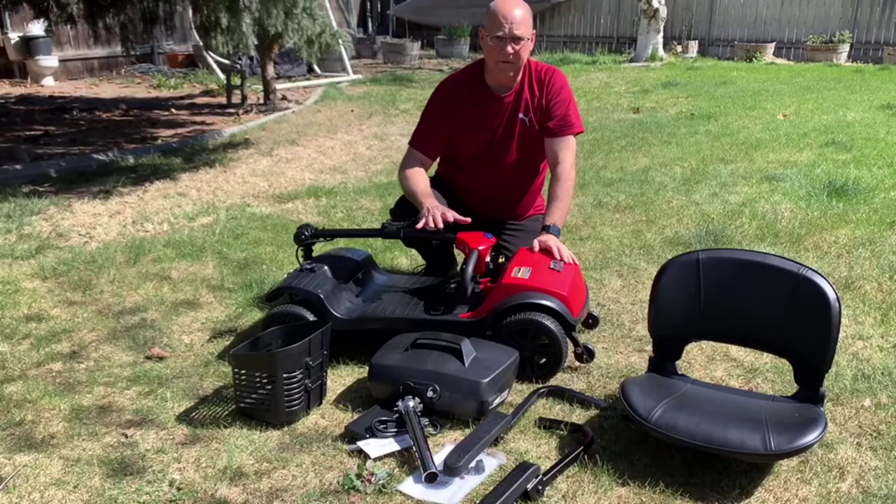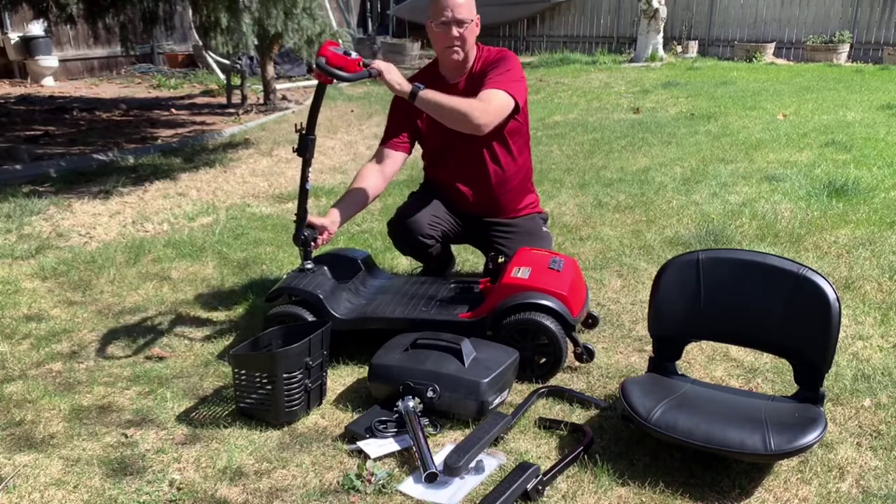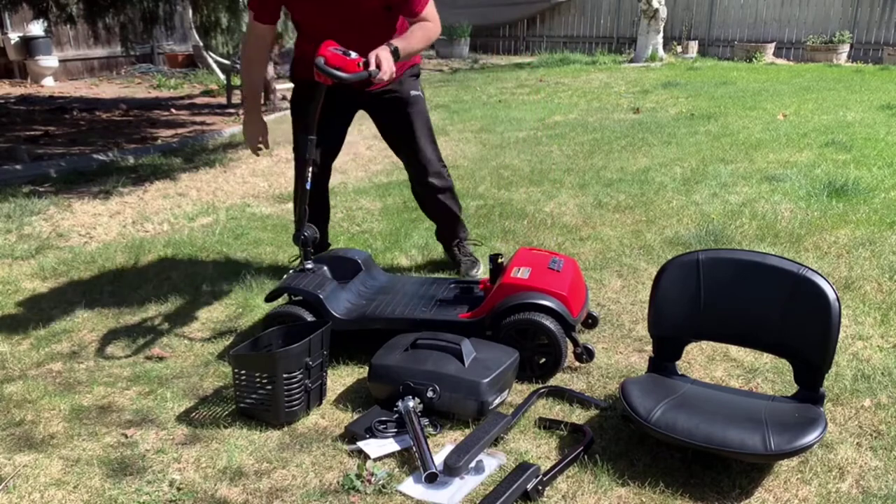The scooter folds down flat, but to assemble it, it's extremely easy. We just raise the front arm and lock it into the place we want it at. We can put the basket on.